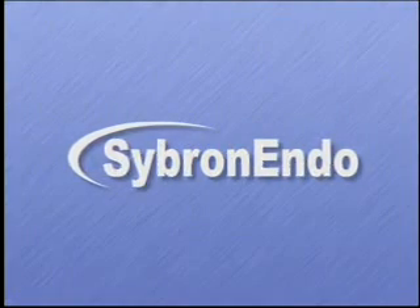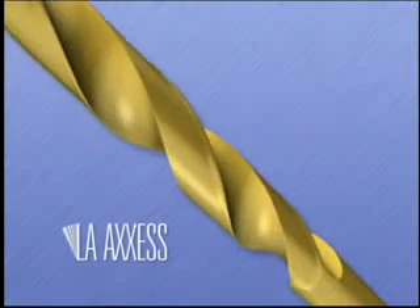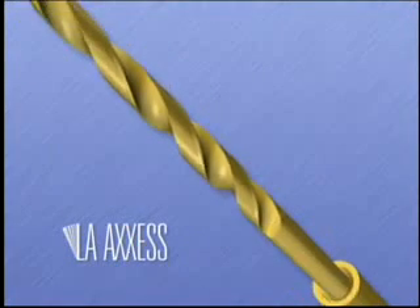SybronEndo would like to introduce the LA Axxess Line of Burrs, a safer and more efficient way to create ideal line angles and convenience form in access preparations.